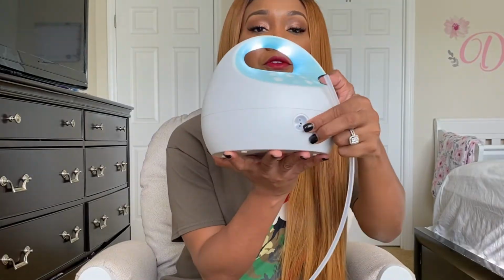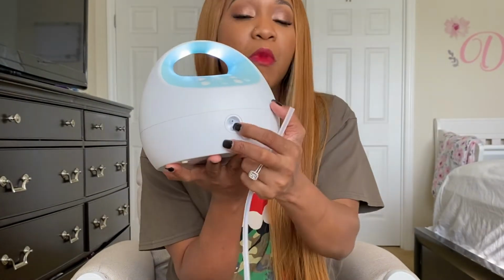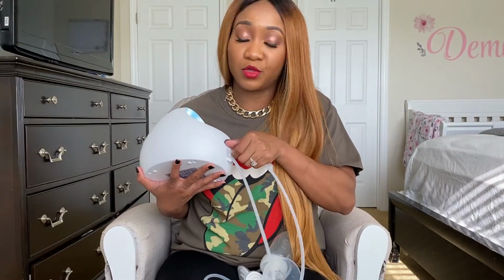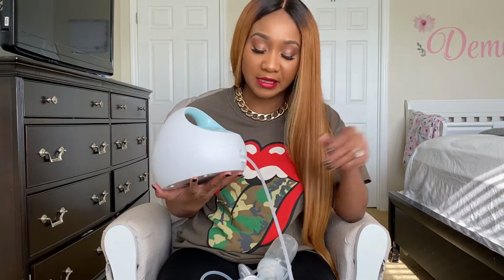It has an option for double pumping. That's important. I think most pumps that come out there, they give you that double pumping option. For exclusive pumpers, it is important that you pump both breasts simultaneously. If you're not pumping both boobs, which I'm not sure why you wouldn't be, only if you're nursing. If you're nursing your baby and pumping at the same time, that's the only reason why you shouldn't be pumping both boobs at the same time.